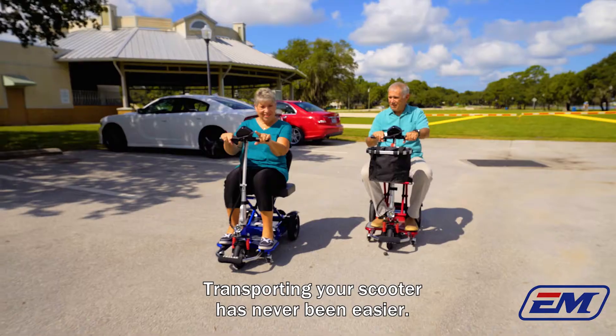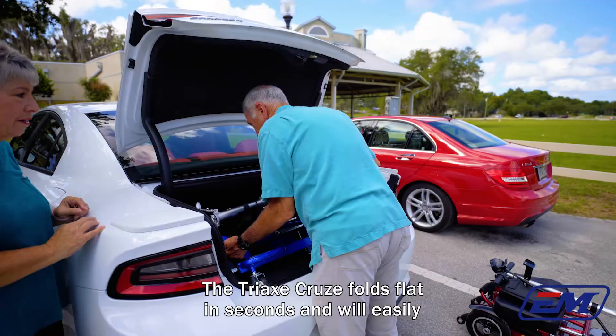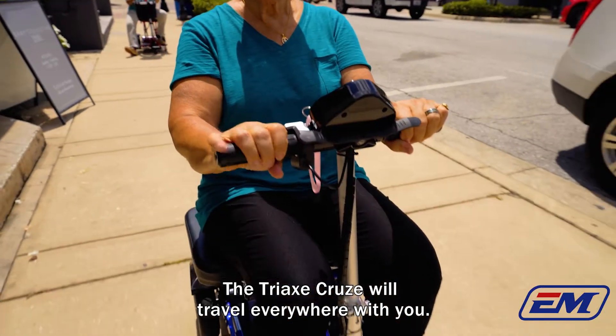Transporting your scooter has never been easier. The Triaxe Cruze folds flat in seconds and will easily fit in the back of most vehicles with no disassembly required. The Triaxe Cruze will travel everywhere with you.